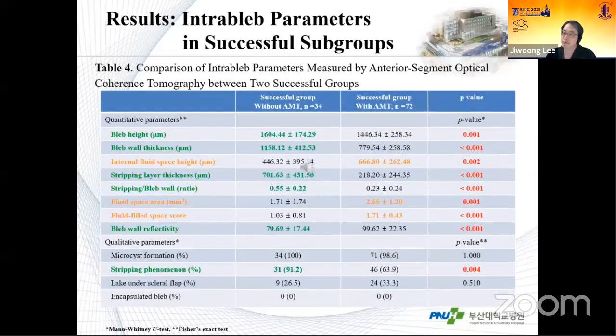When we compare intrableb parameters between the two successful groups, we can see that bleb height, bleb wall thickness, stripping layer thickness, and stripping to bleb wall ratio were greater in the control group, and stripping phenomena were more frequent in the control group, whereas internal fluid space height, fluid space area, and fluid filled space score were greater in the AMT group.